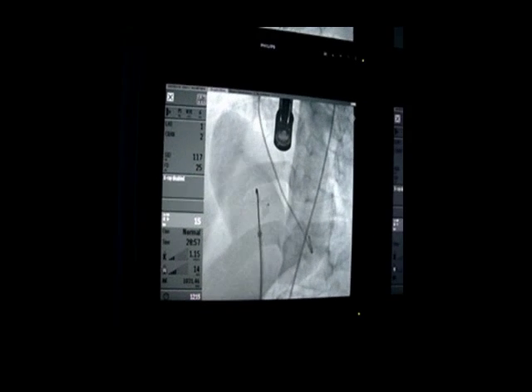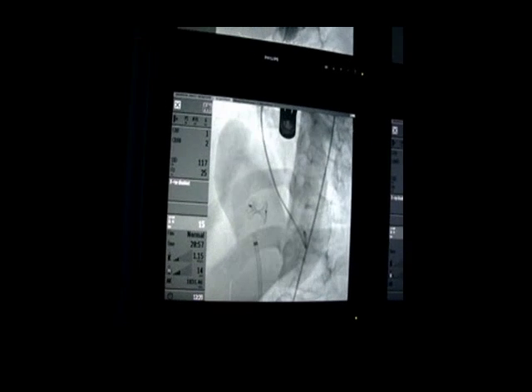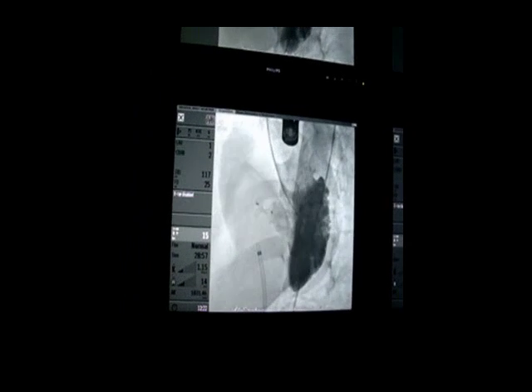So then we decided to release the device. Oh my God!